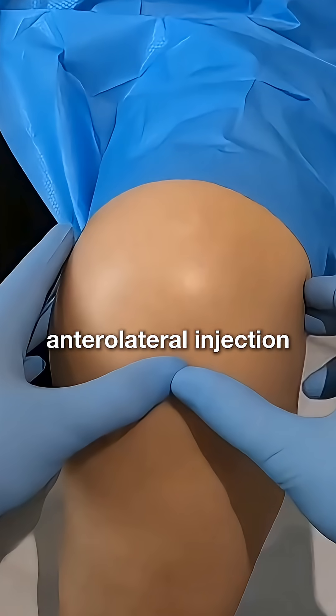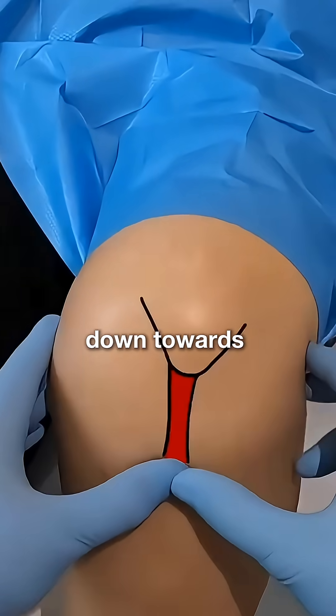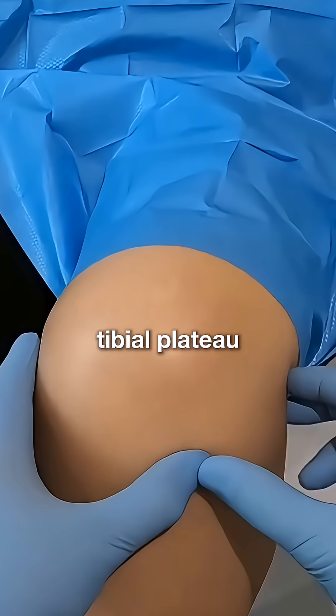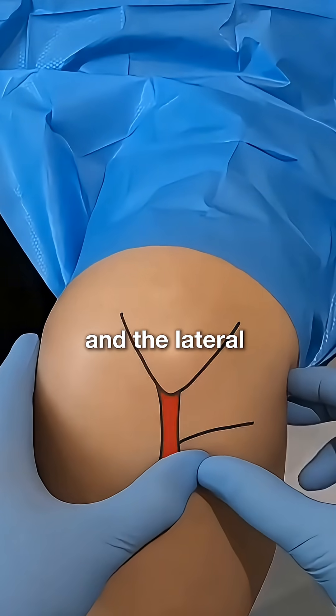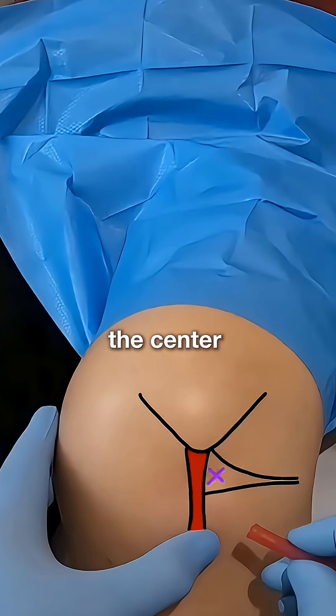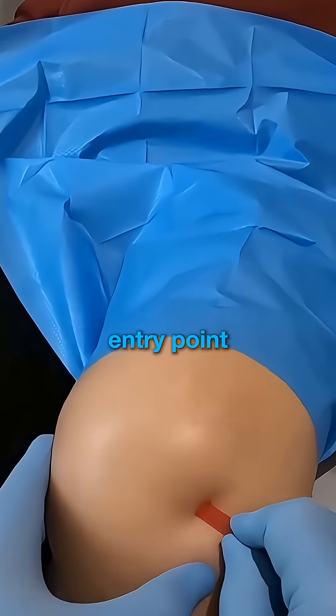For the anterolateral injection, identify the inferior pole of the patella and then follow the patellar tendon down towards the tibial insertion. This line constitutes the medial edge of our target area. Then, palpate the lateral tibial plateau, which marks the lower edge, and the lateral femoral condyle, which marks the upper edge of the target area. The centre of this area should be a palpable soft region and is our needle entry point.